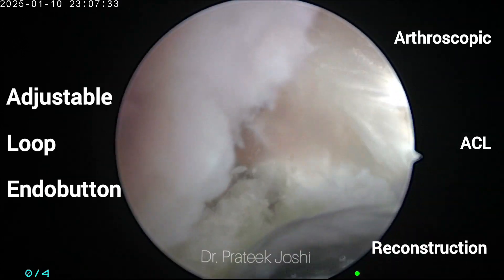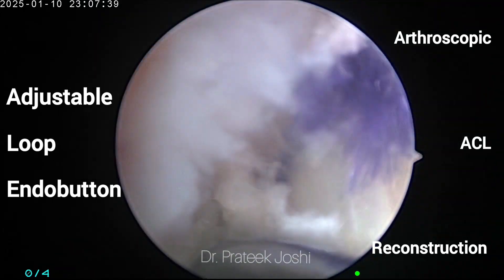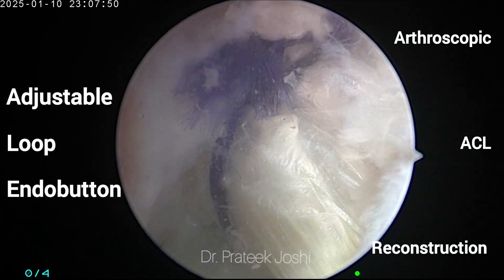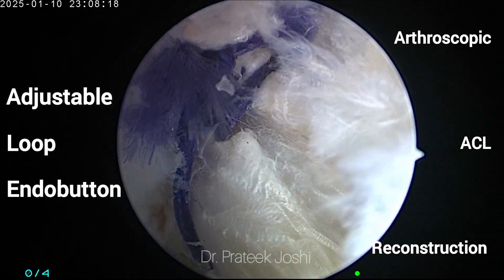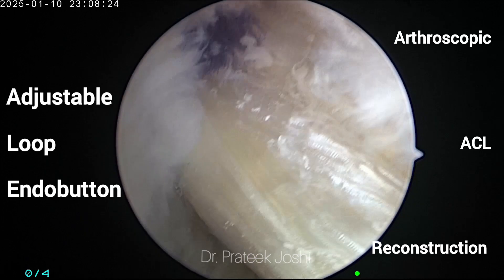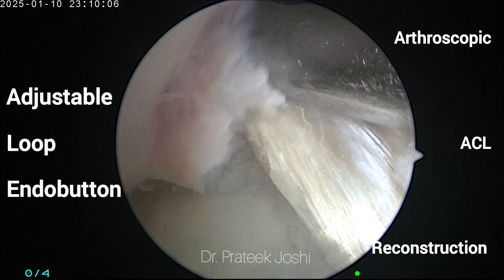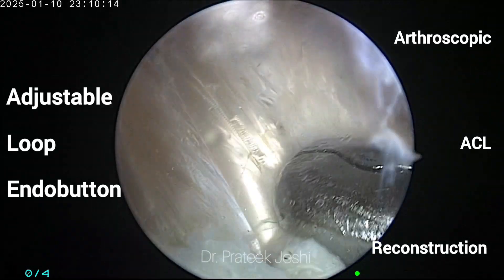So at this stage we are going to tighten the sliding knot which is in the adjustable loop, and this is going to advance the graft from the tibial tunnel to the femoral tunnel. The vicryl that we are able to see is at the 20 millimeter mark on the graft, which is the length of the graft that we want inside the femoral tunnel. You can clearly see it is already sitting nicely in the femoral tunnel and the graft has reached up to the 20 millimeter mark.